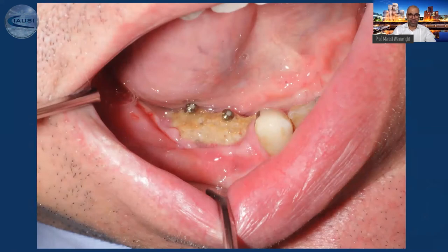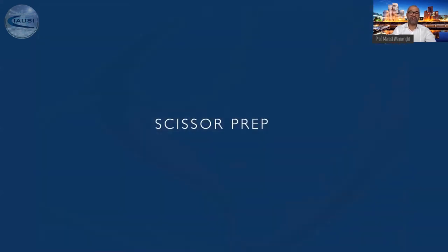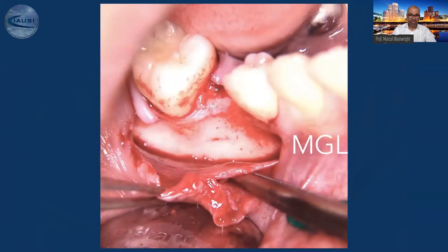But this is the worst case scenario — a case I did. What went wrong here was a wrong or not fully effective manipulation of the soft tissue. That's so important, because if this bone is exposed, you don't need to think about grafting it again or placing membranes — this will never heal in. We should avoid this by using what I call the scissor prep.